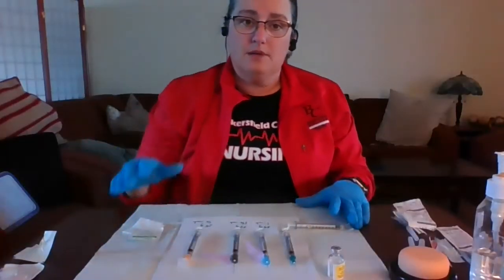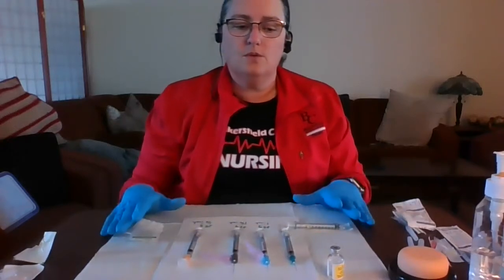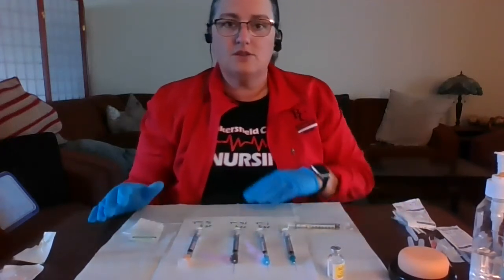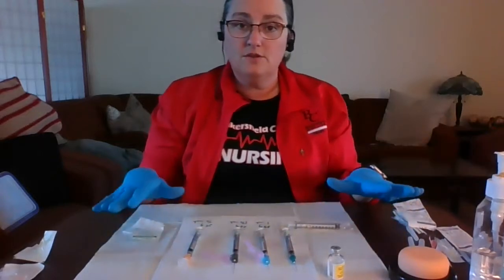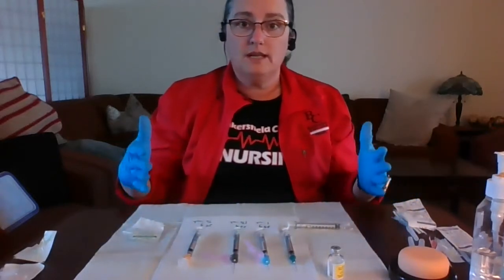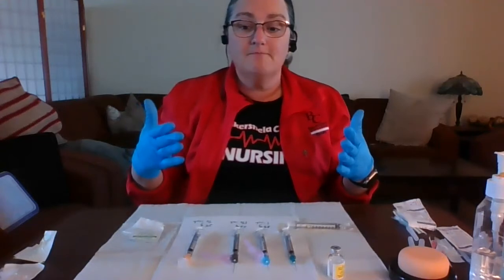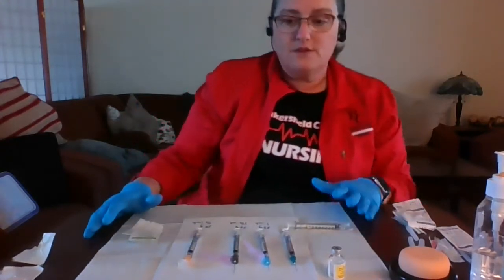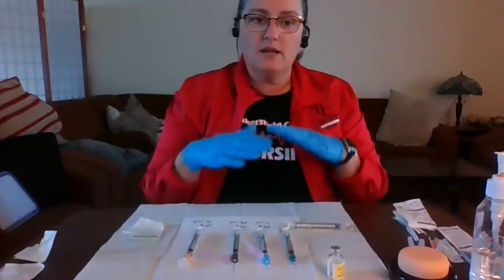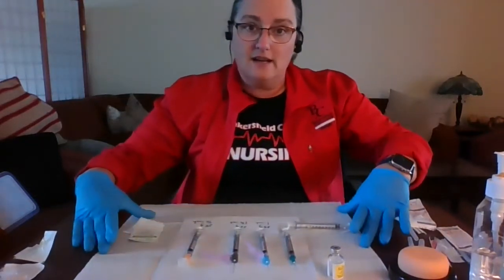Okay, let's talk about supplies. The bare minimum supplies that you would need in order to perform vaccine administration safely would be something to clean your space. And you may be working in a vaccine clinic, a drive-through clinic, and not have the typical setup that we would have in a medical facility. So we have to still think about keeping our area clean and doing the best we can in that scenario.